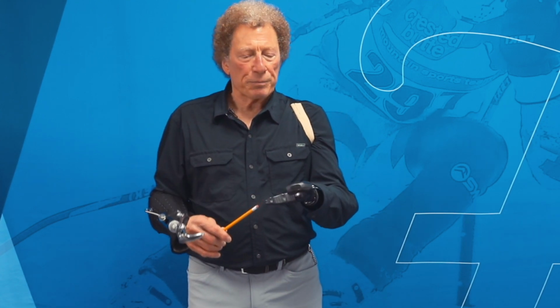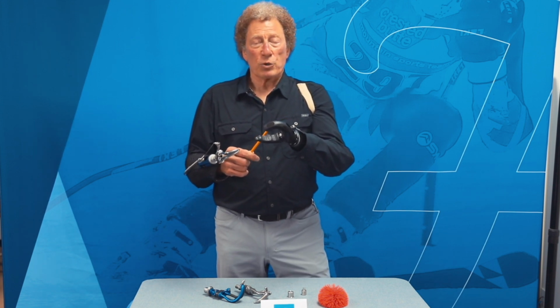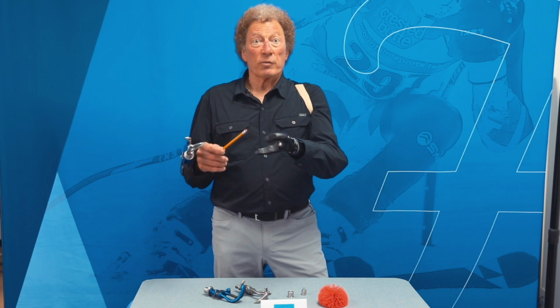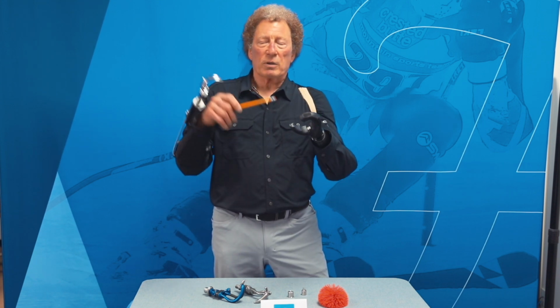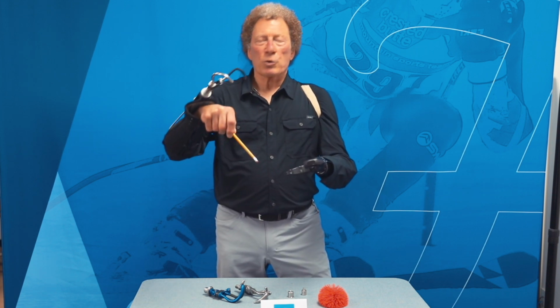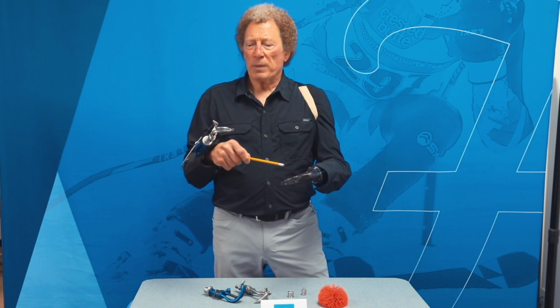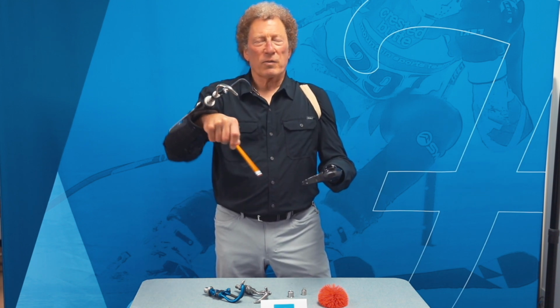So let's talk about the prehensor. Voluntary closing, all of the same motions to operate, but what does a voluntary closing prehensor, or a voluntary closing device in general, give you? It gives you proportional grasp. First of all, it's very easy to close. It's very efficient, far more efficient than a split hook. Many people get confused when they're used to using split hook technology, and they think, well, it must be as hard to operate a voluntary closing device as a voluntary opening.